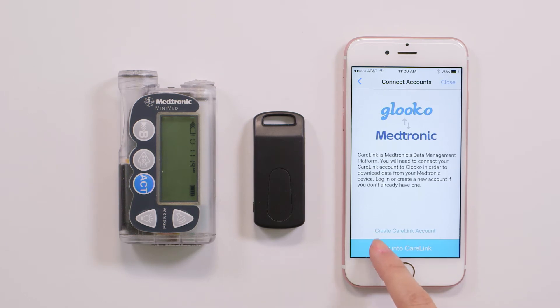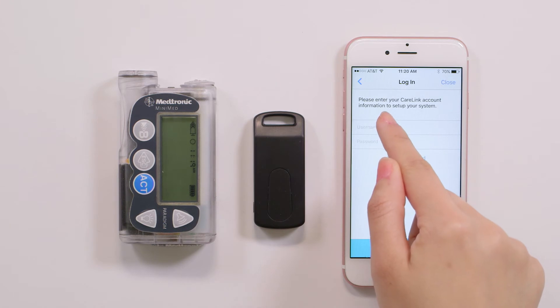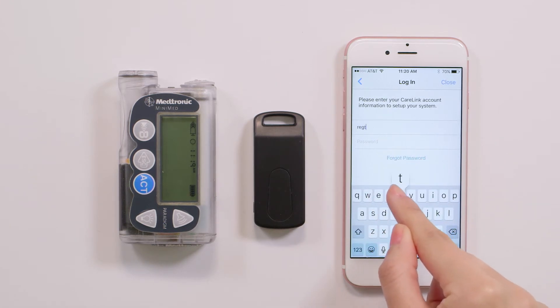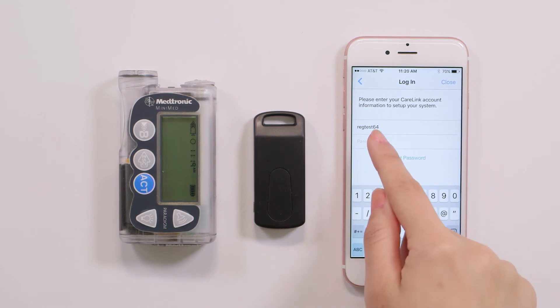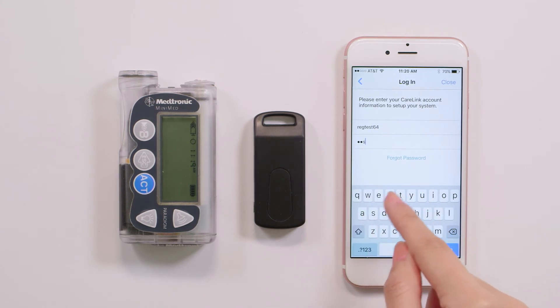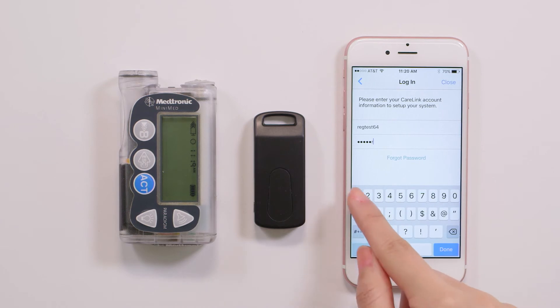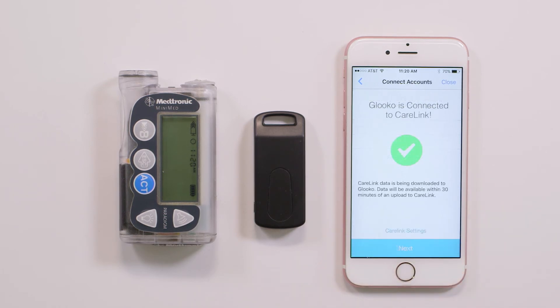Tap 'Login to CareLink' and enter your CareLink account username and password. By signing into your CareLink personal account, you are allowing Glooko to access and display your Medtronic data in the Glooko mobile and web apps. Your CareLink personal account is now connected to Glooko, as shown by the green check mark.